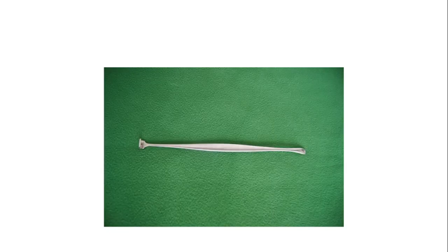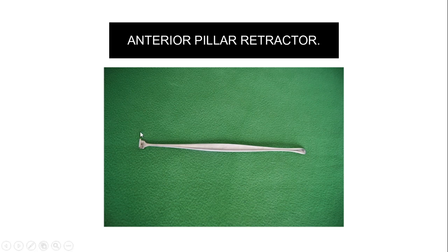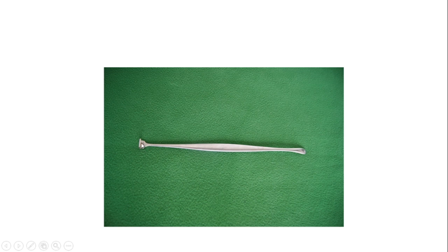This is the anterior pillar retractor. The anterior pillar retractor — one of which is the Miner's retractor — is placed on the anterior pillar and used to retract the tissue away from the tonsil.